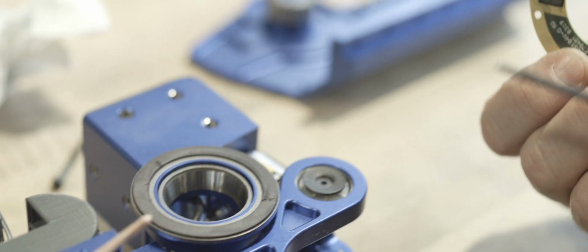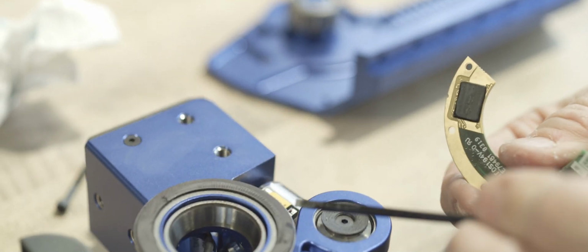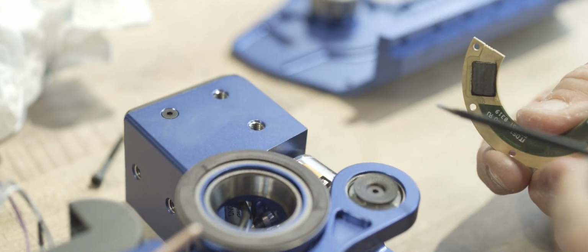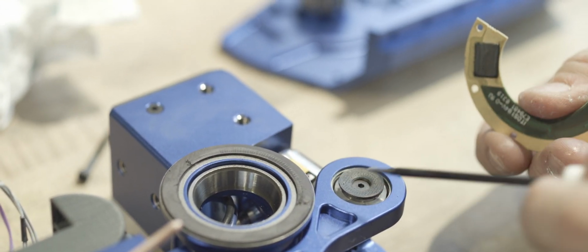Why is that important? Well, there's supposed to be a specific distance between this read head and this ring. I don't know, a few thousandths of an inch. That's pretty precise. And if it's off, if it's too far away, it won't work. And if it's too close, well, it won't work, in addition to, it'll wear away the ring.